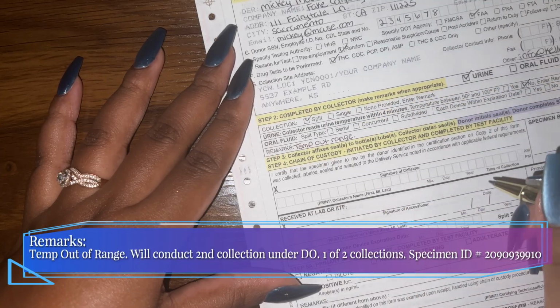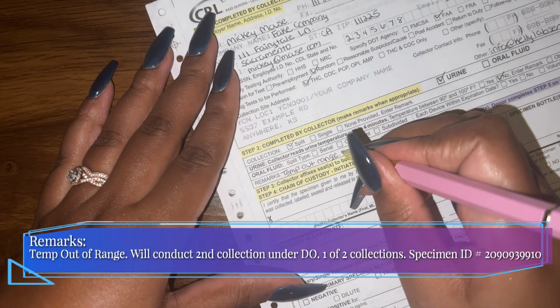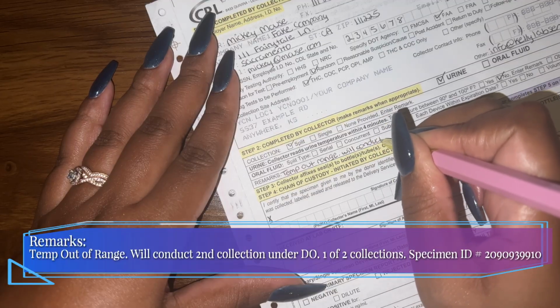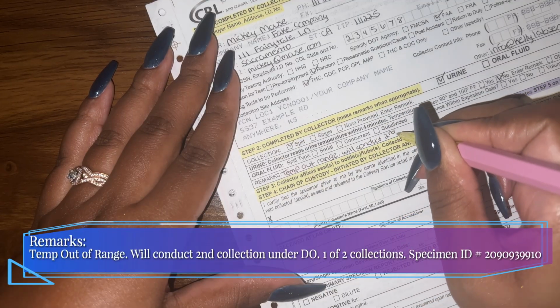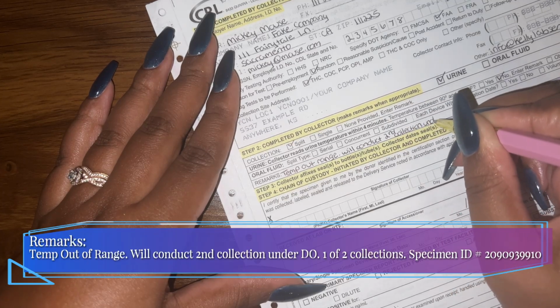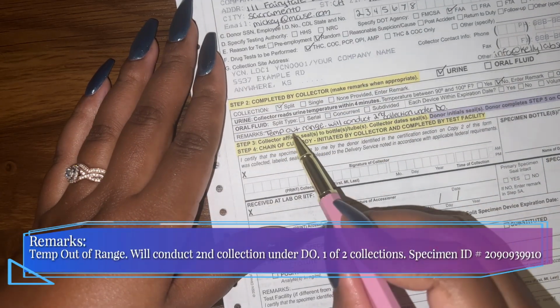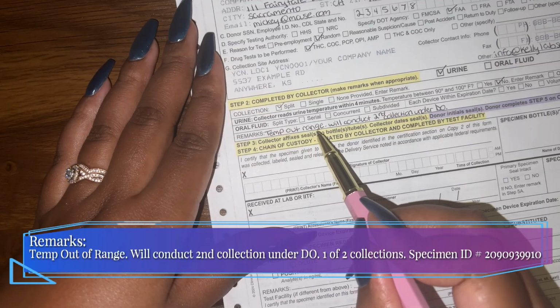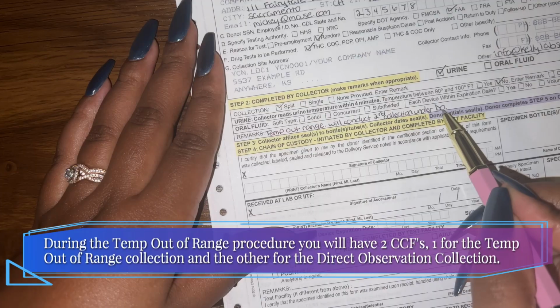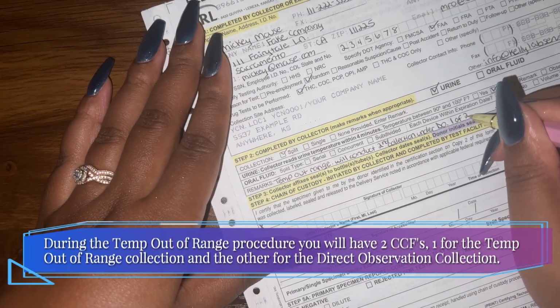Now we're going to tell them, what are we going to do since the temperature is out of range? So we will say, will conduct second collection under DO. DO stands for direct observation. So we've told them the temperature is out of range. Now we're telling them we're going to conduct a second collection under direct observation. Then we're going to say this is one of two collections.